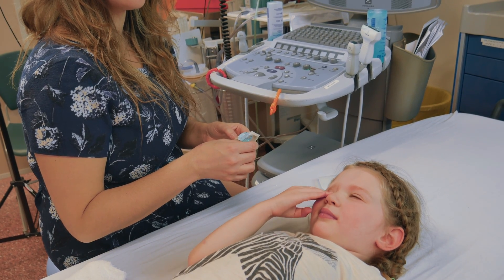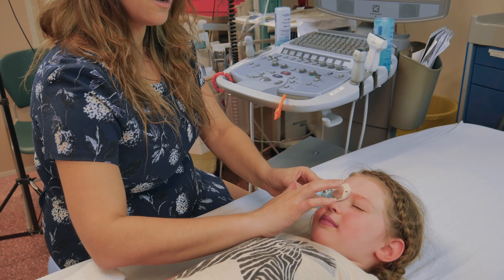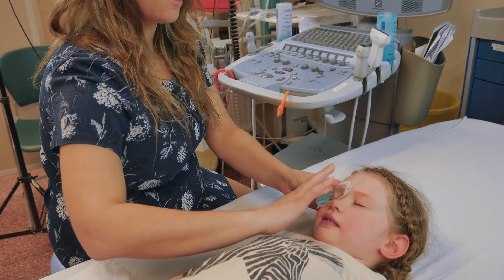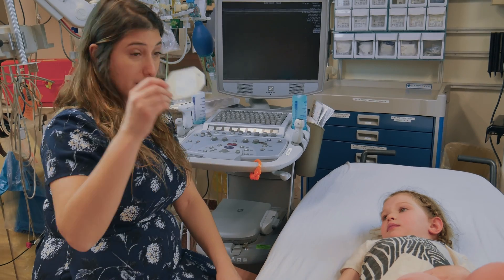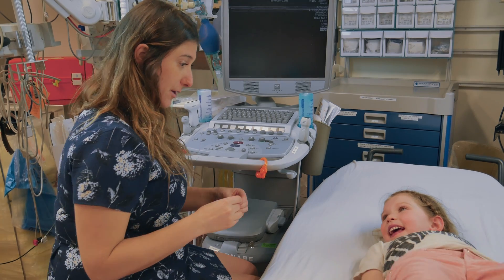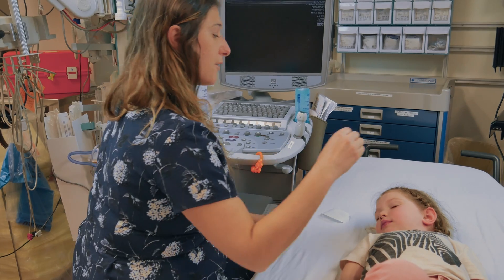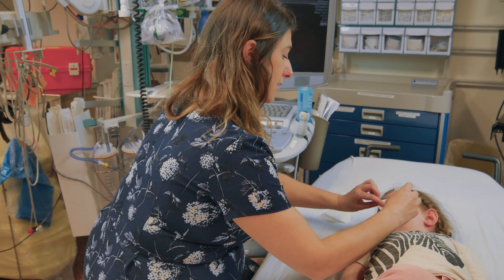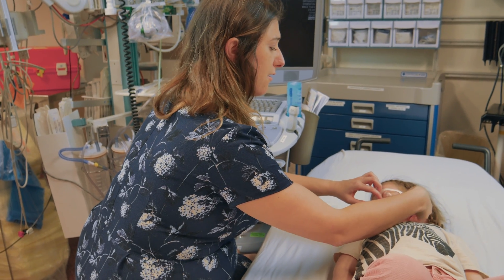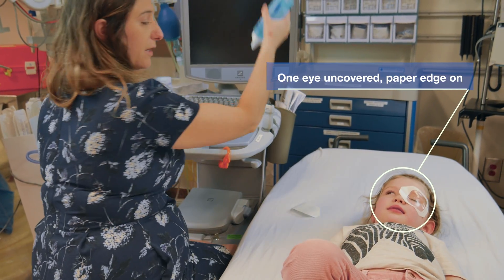As the eye is a mucous membrane, we use a tegaderm to cover the eye before scanning. This ensures that gel does not enter the child's eye, that the probe does not contact a mucous membrane, and it facilitates cleanup. Other sites may not use a tegaderm — discuss the need at your center with your infection control department. Use a size large enough to cover the entire eye and surrounding orbit to prevent gel from getting into the patient's eye. Cover one eye at a time to help comfort the child, as they can still see out of the uncovered eye.